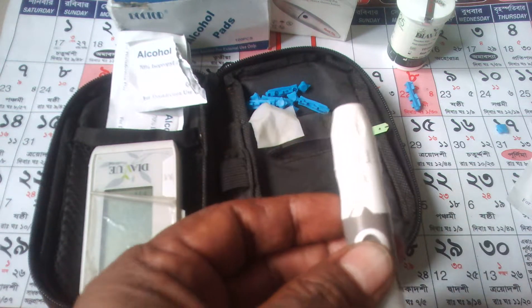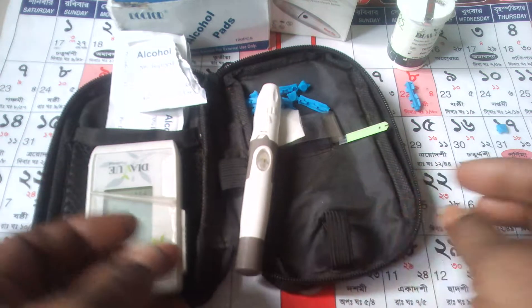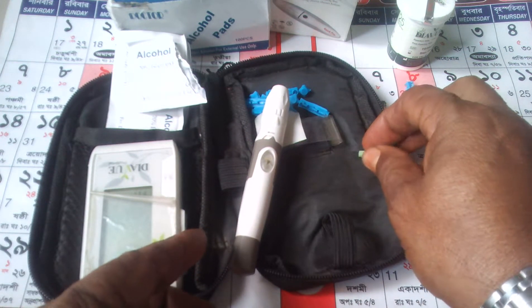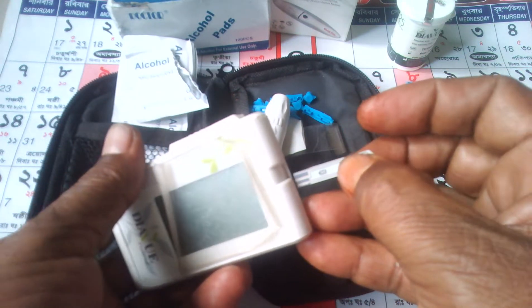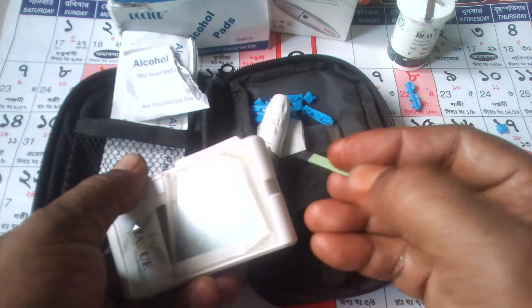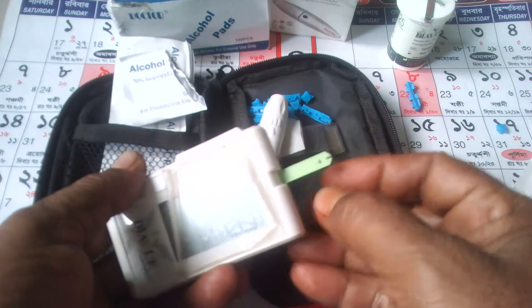Measure there and take a stick. Put in the machine.